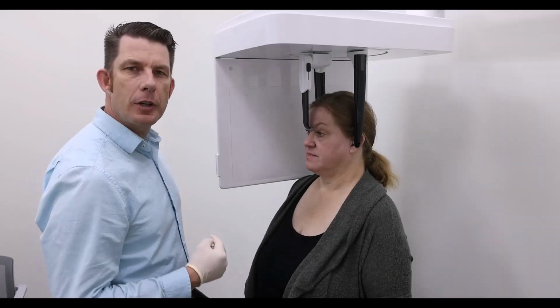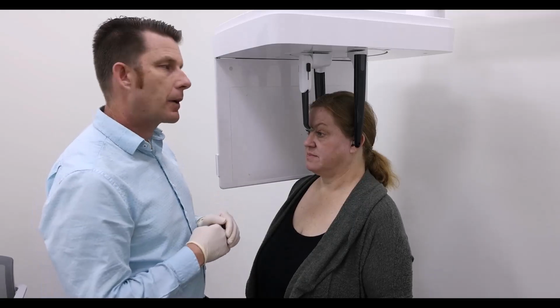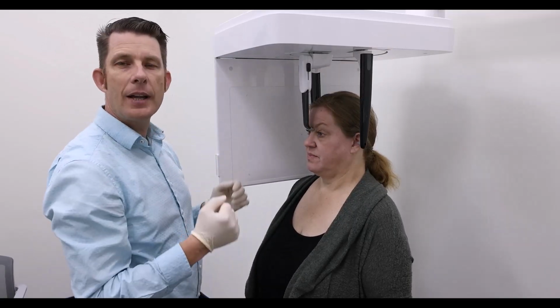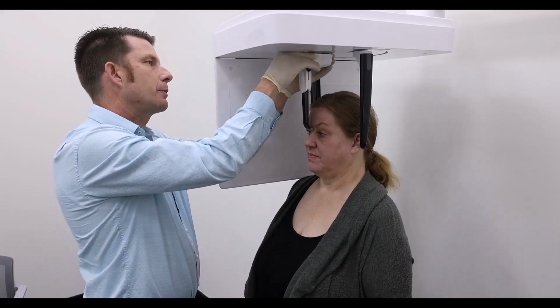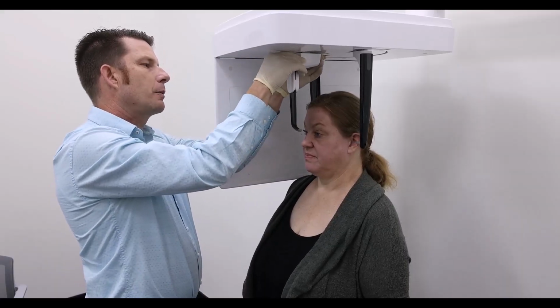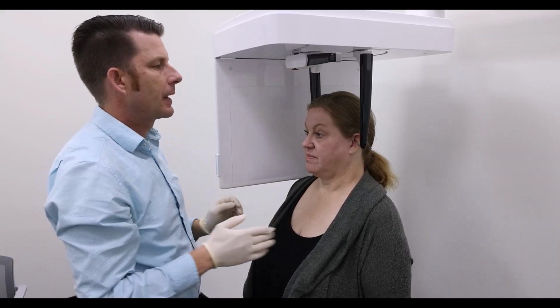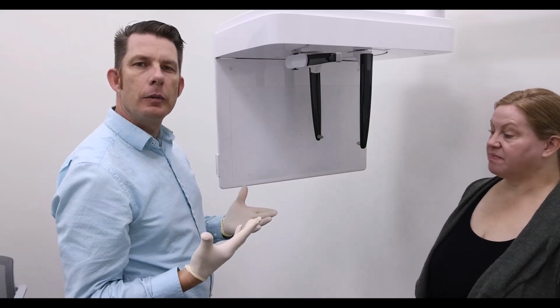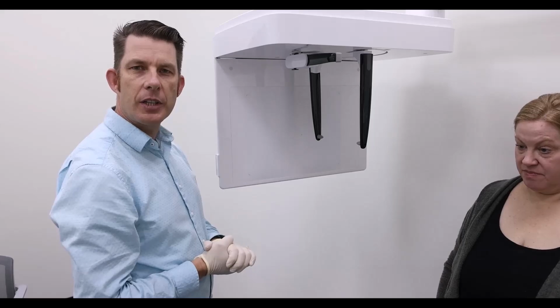With our image capture complete, I'm going to release our patient from the device by moving our ear rods out of the way, our temple support forward, rotating this up. You can go ahead and take a step back, and that was our lateral Ceph patient positioning.